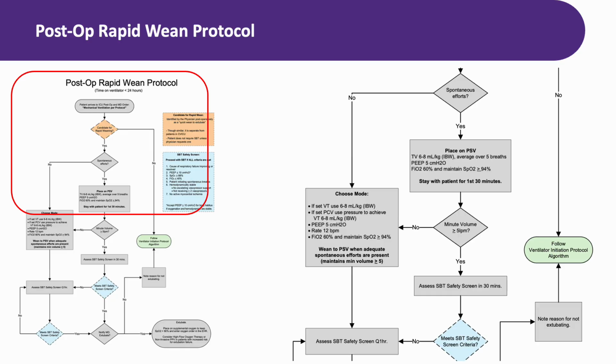Now, here's an alternate pathway for patients who were placed on pressure support initially because they were spontaneously breathing on their own on arrival. For these patients, look at the algorithm. You assess for extubation readiness at 30 minutes after arrival. Do they meet the safety screen criteria?